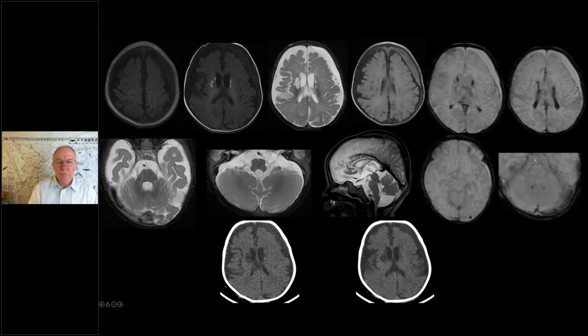I think there are some tiny foci of hyperdensities, probably calcifications, but the rest of the blooming foci do not correspond with any calcification. So a cavitatory lesion in the bilateral basal ganglia with a mixture of calcification and hemorrhage, old hemosiderin deposits, and bilateral subdural collections. I could not appreciate any tortuous vessels, at least on the non-MRA scans. And yeah, so those are the findings.